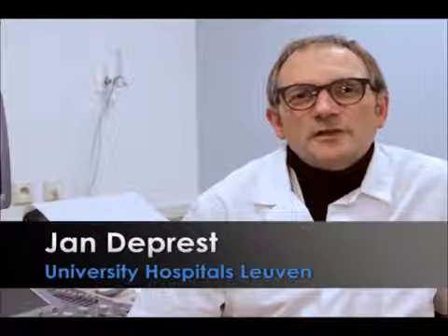The experiment will be demonstrated by Dr. Ryan Hodges, obstetrician and postdoctoral researcher, together with André Lagerche, a cardiologist and postdoctoral researcher, together with Drs. André Miyage and Philip de Koning, obstetricians in training and doctoral researchers at this department.